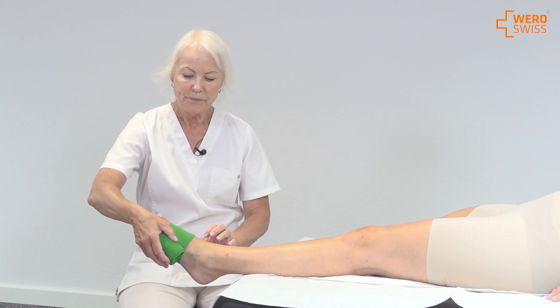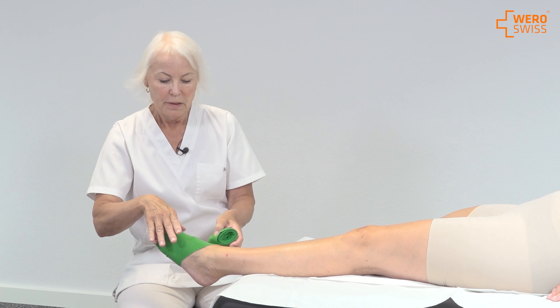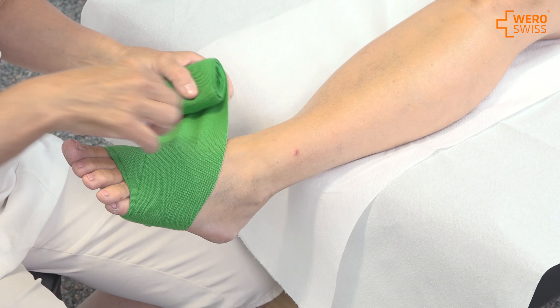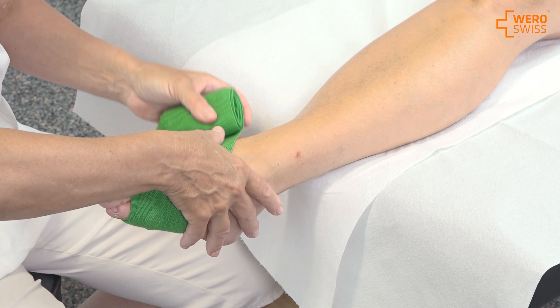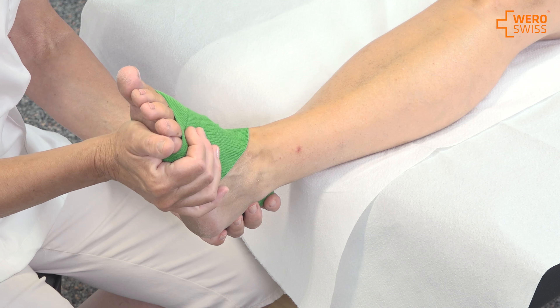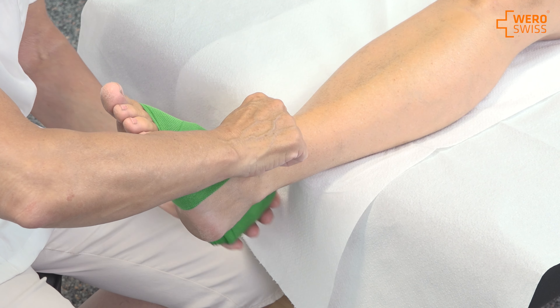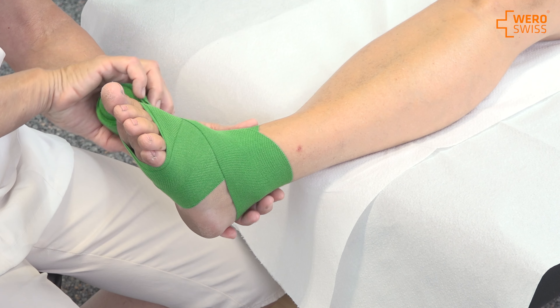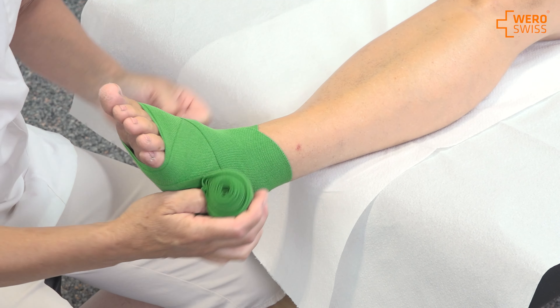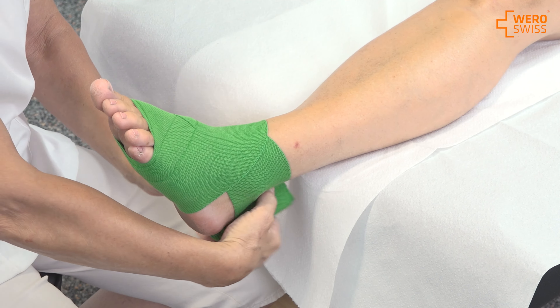Then you continue with the figure-eight. You overlap more tightly than 50 percent — here we overlap like 70 percent. I ask you to just fold your foot a little bit, continuing up over the ankle, going down, going up again, going down and going up.